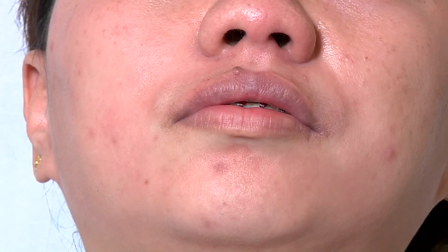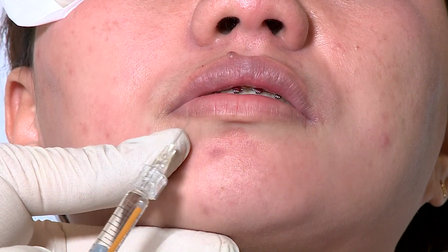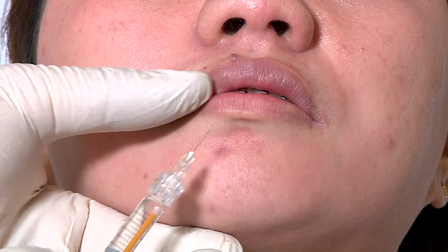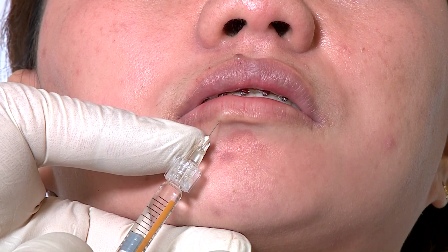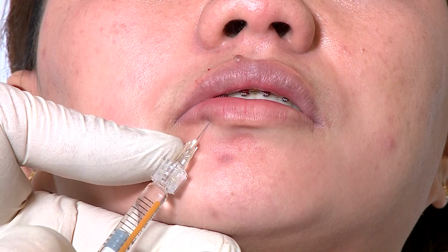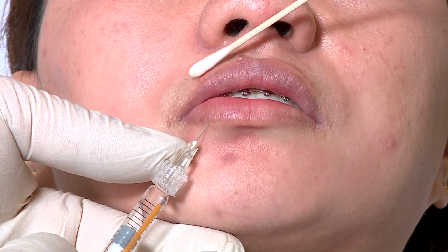Our target here is more rejuvenation. As we can see, there is minimum bleeding. Also doing the lower lip, approaching from the skin at exactly the vermilion line, 0.1 and another 0.1, almost double the amount that I injected in the upper lip.